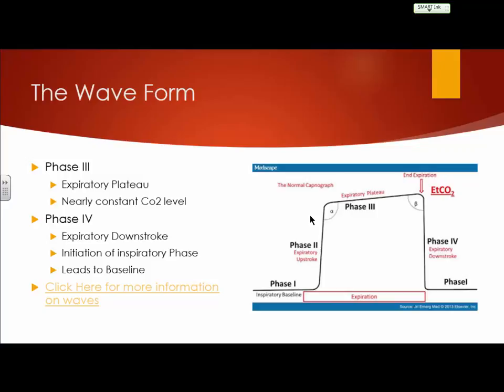So the drop-off of the expiratory phase, is that the equal atmospheric pressure? Have you hit that part right there? At the point. Yes. And so once it starts going down, you're starting to inspire then, right? And then it plateaus at the bottom when you stop the inspiration, right? Right, when it peaks back up.